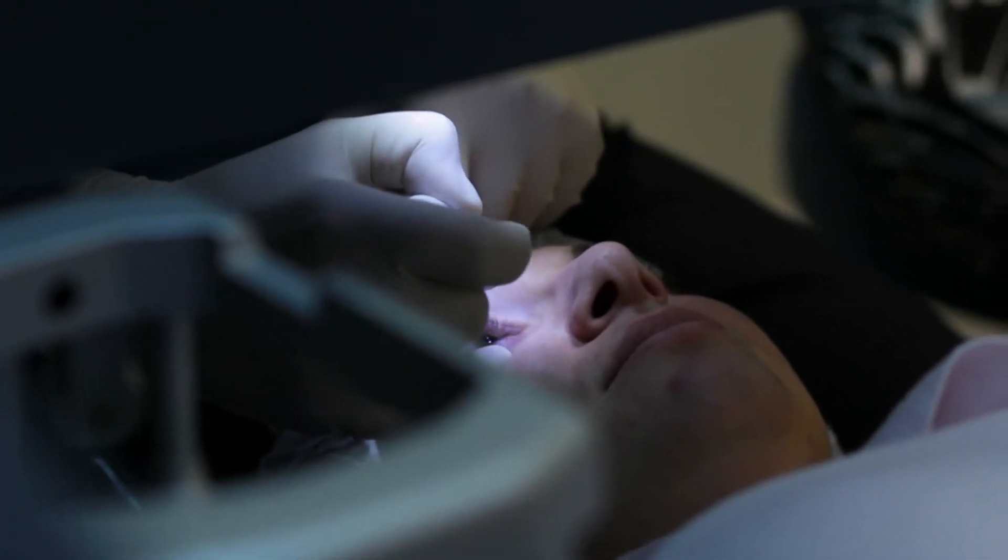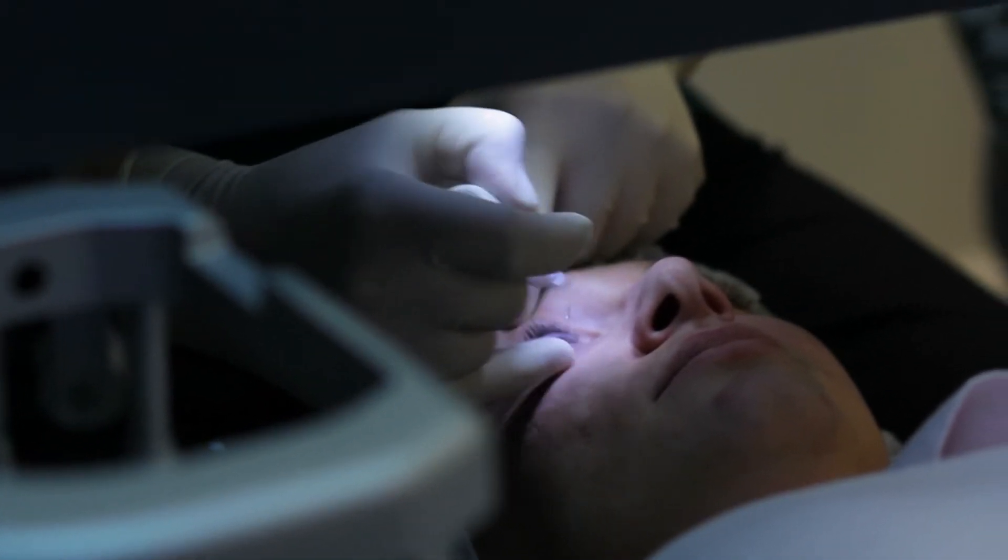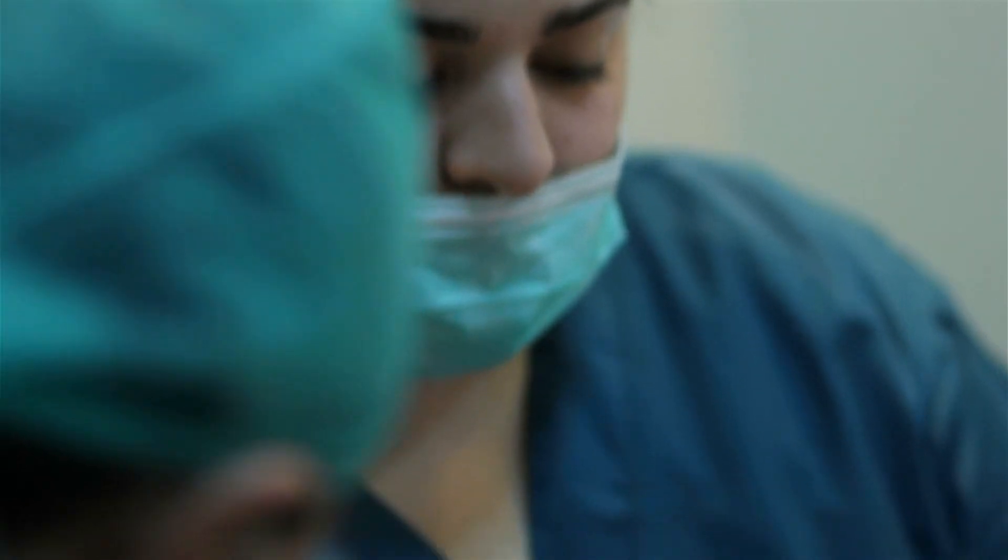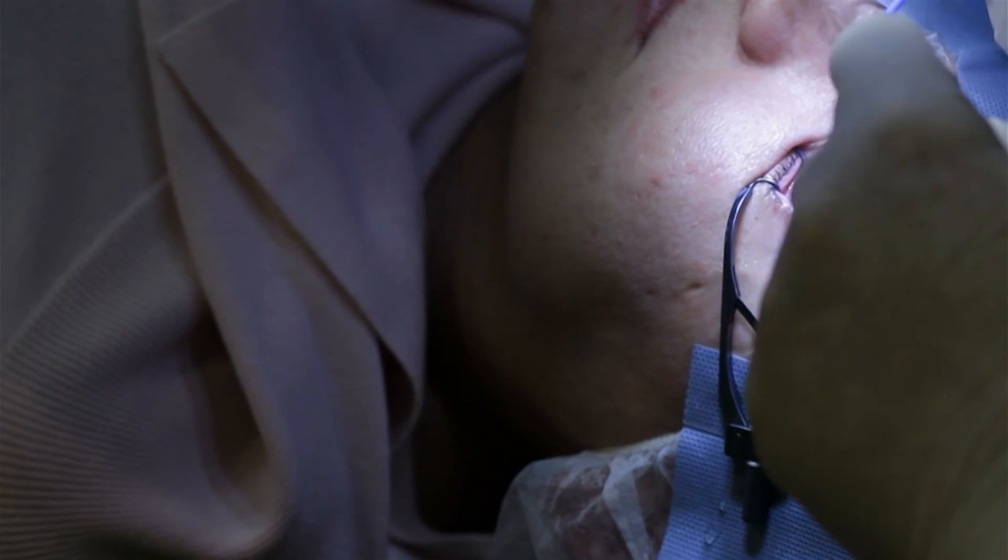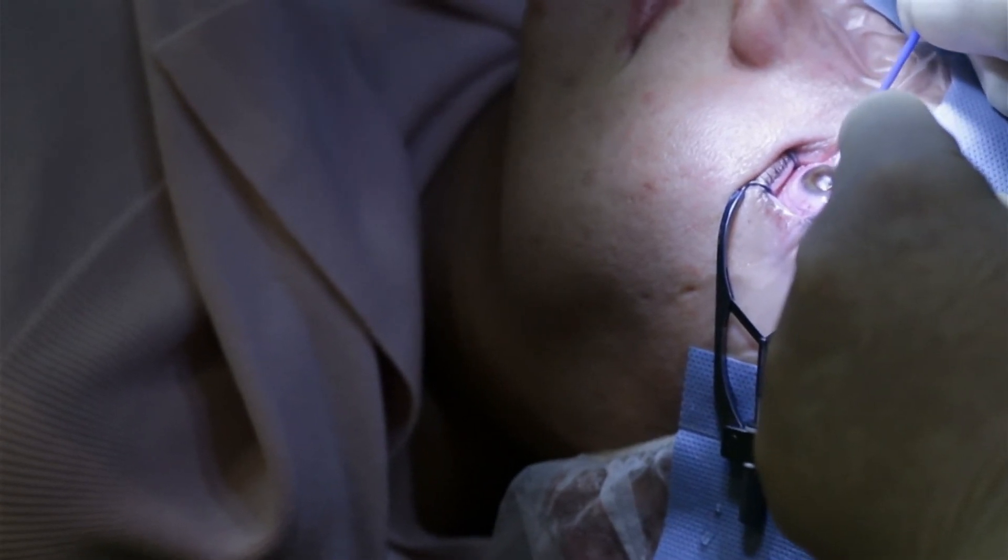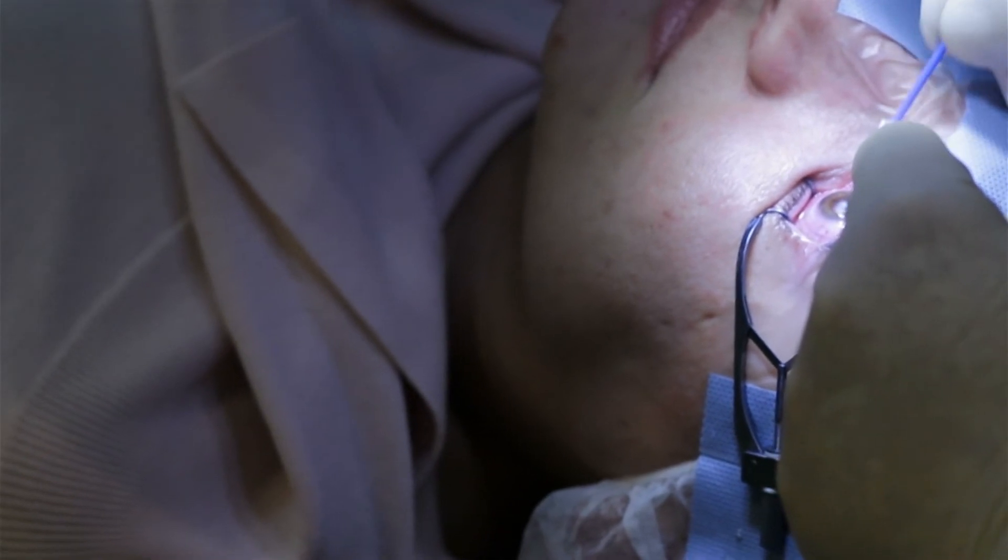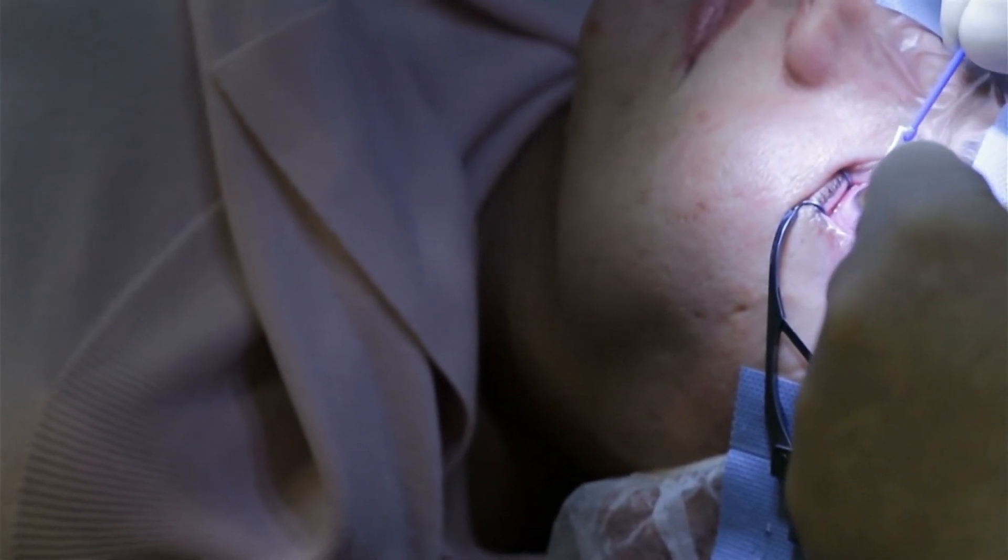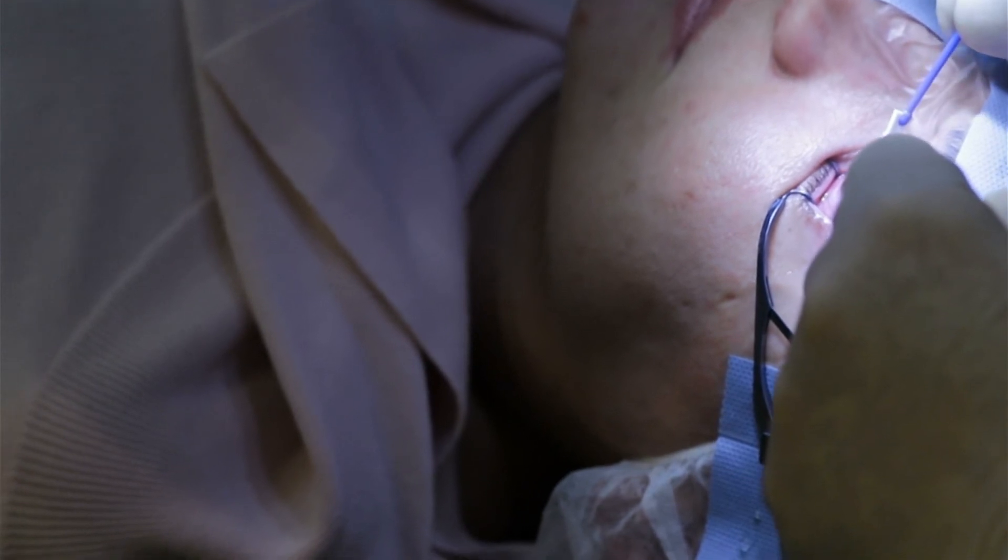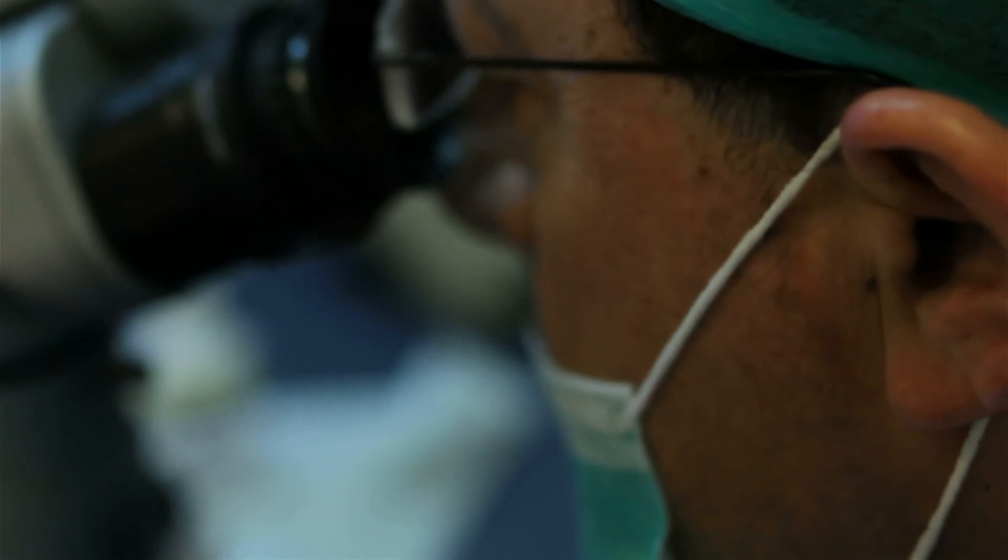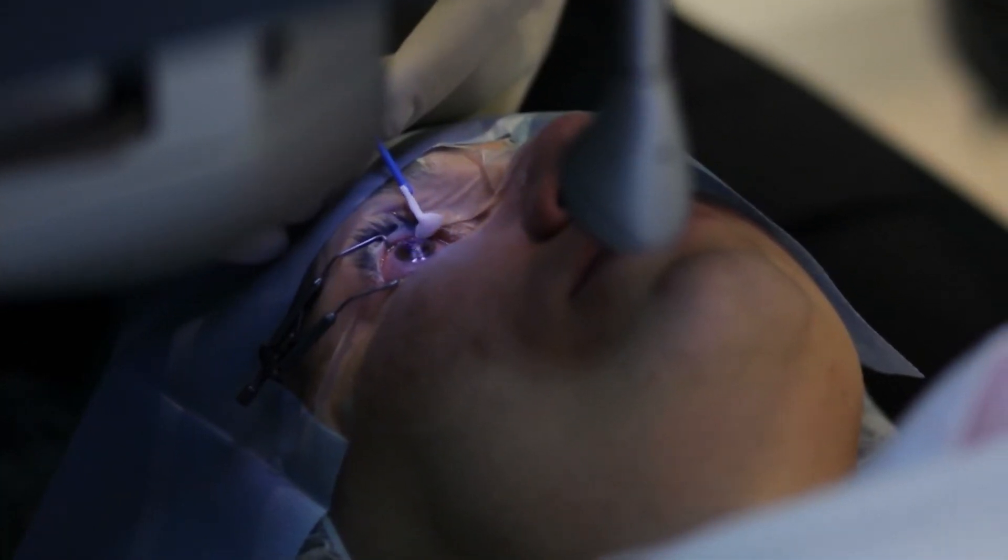We put some more drops and anesthetic drops in the eyes. You don't need any injection. Then we put the speculum, which is this small instrument that holds the eye open. So this is a very delicate flap that I created from the surface of the cornea. And this is the eye tracker. This machine, which is called a microkeratome, cuts very thin flaps and it's very safe.